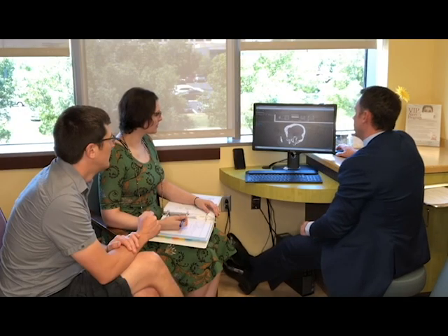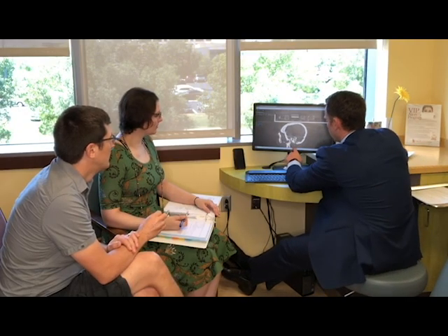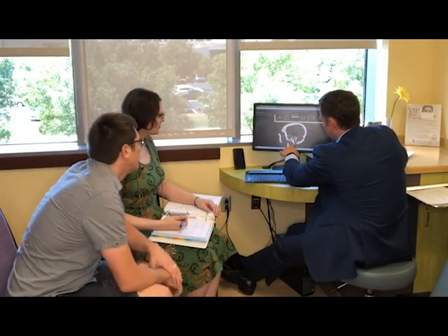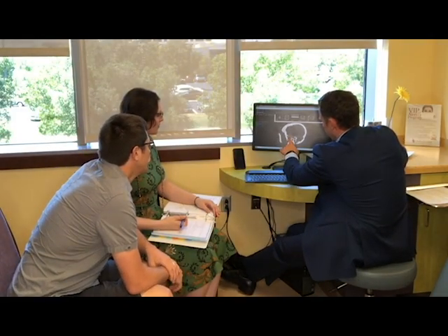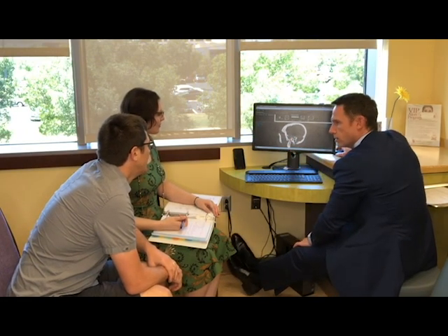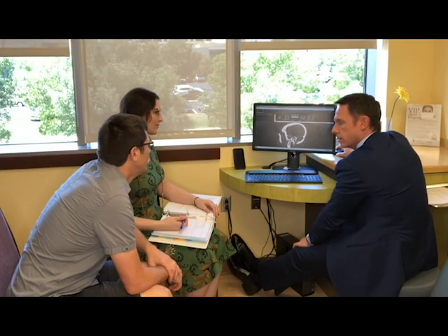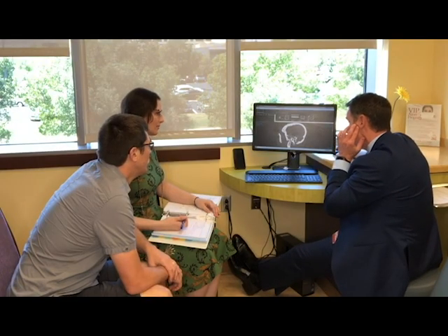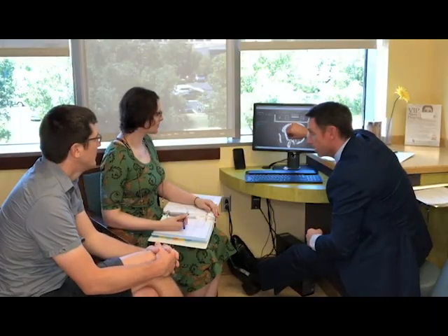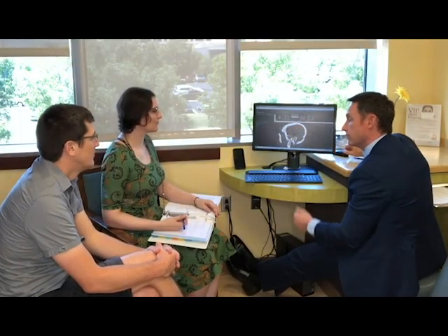Okay. So this is, you mentioned TMJ. So this is the connection of the jaw with the skull, right here. So it does get very close to that. It's not involving what we call the mandible, because it's a separate bone. But the intersection where the mandible, almost a socket where the mandible hits the base of the skull, that is very, very thin, possibly involved there. So that's one issue that we'll talk about.